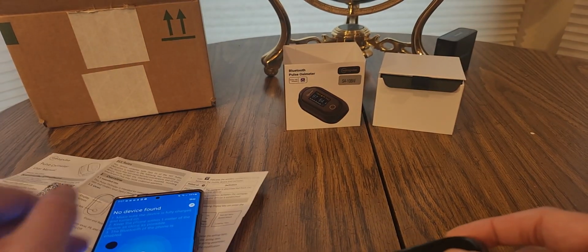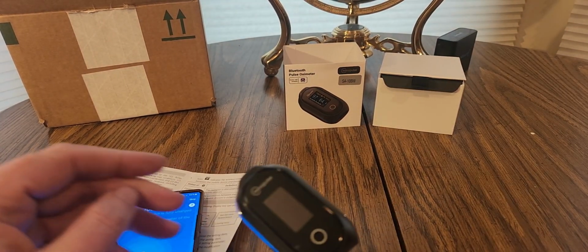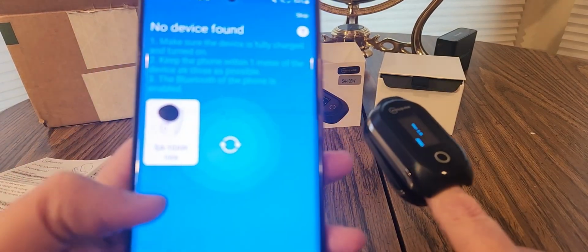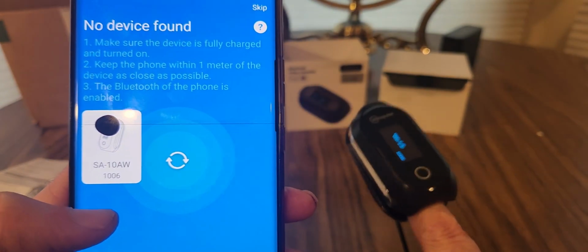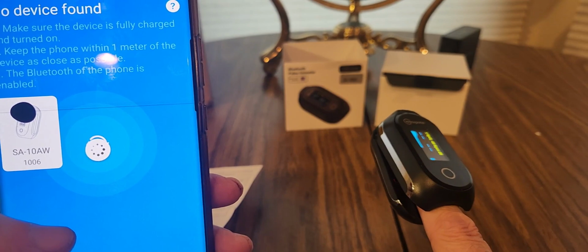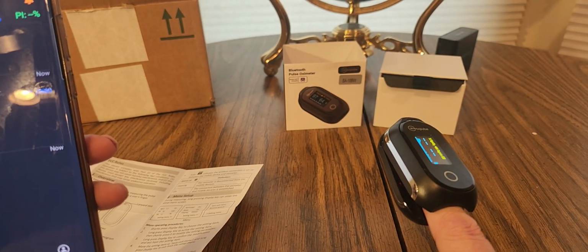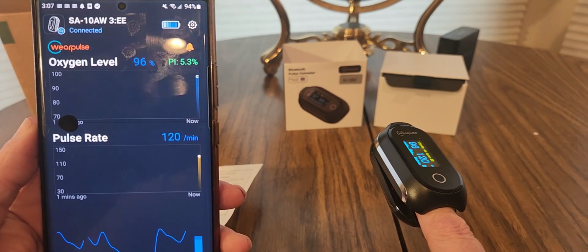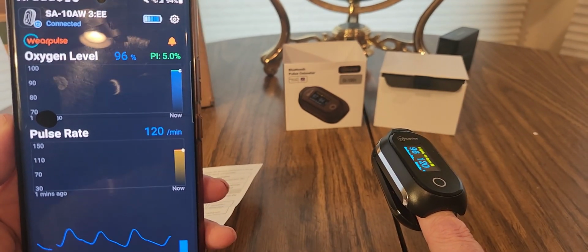Maybe I gotta put my finger in it. Turn it on. There we go. So once you get it, put this on your finger, and then it will connect to it. Whoa. Pulse rate, oxygen level. I think I'm alive.